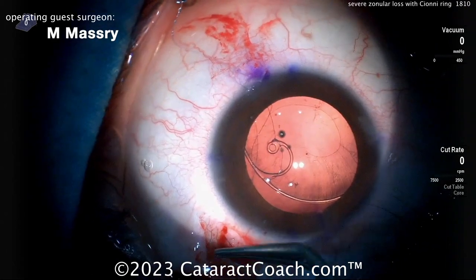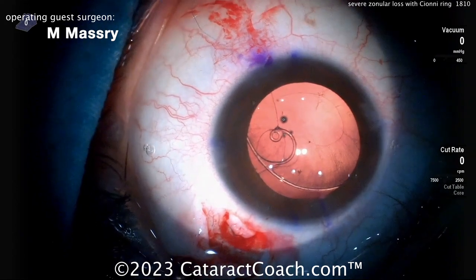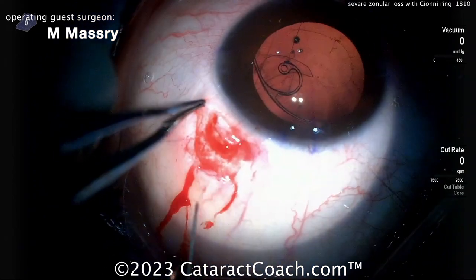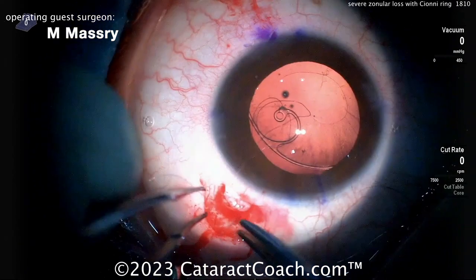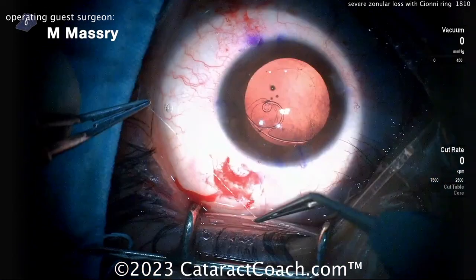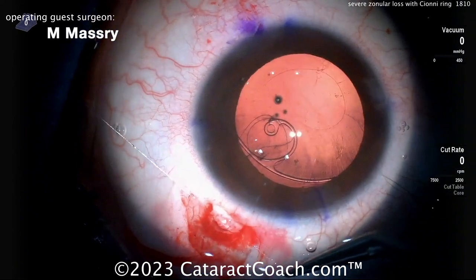Will this 10-0 prolene hold up over time? It pretty much should — it depends on the age of the patient. There are other options: you can use larger sutures like a belt-loop type technique with a bigger prolene like 6-0 prolene, or you can also use Gore-Tex material. Lots of options. Tying that up — good tension, not too much, just enough.